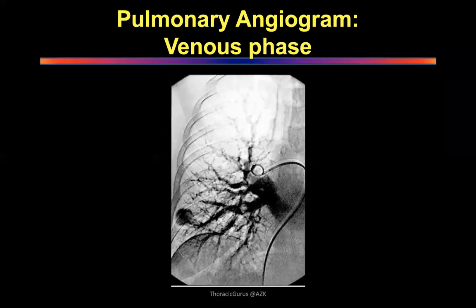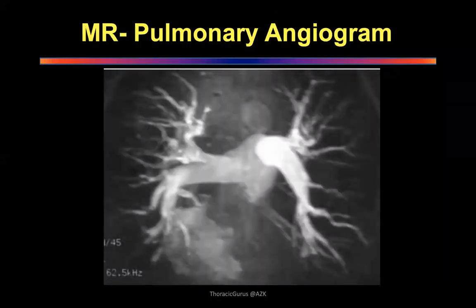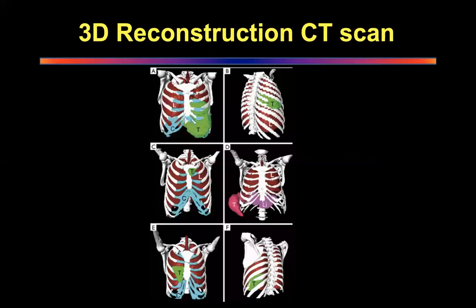You will get different pathologies which will get picked up by these technologies. And MR is very, very good for angiography. MR gives you an excellent reproduction of an angiography. Only problem is MR takes a very long time, and with many thoracic pathologies, the patient may not be able to lie down for 40-45 minutes for the MR acquisition. So that's the problem with doing MR.